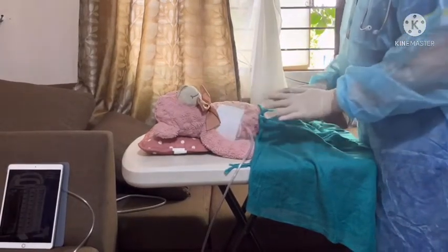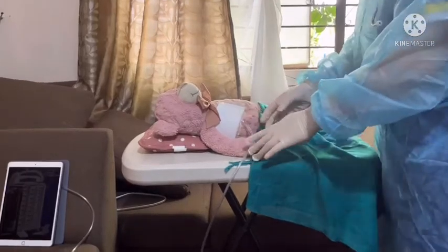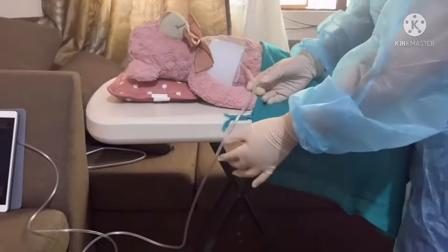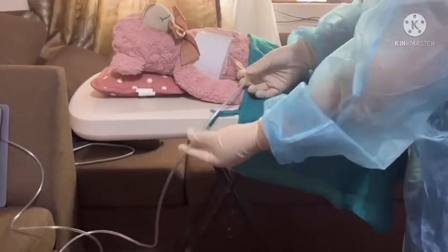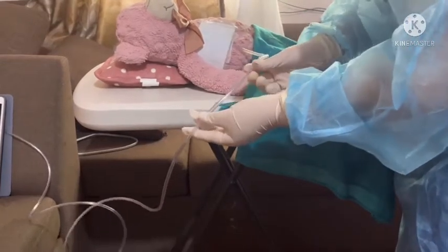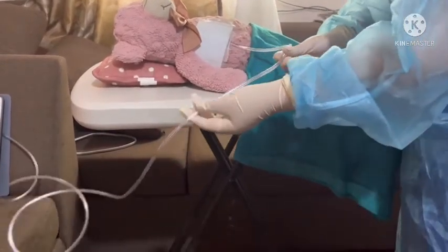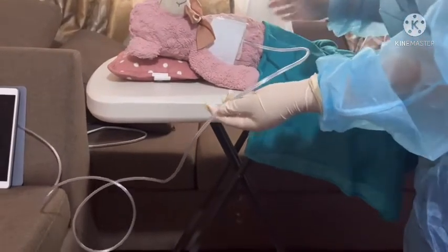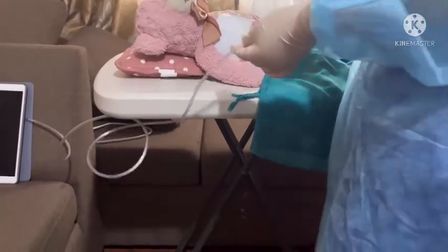Let's go down to the tube. Let's check the connection of the tube, then check if there's any clog or damage to the tube. Then make sure that the connection is good.